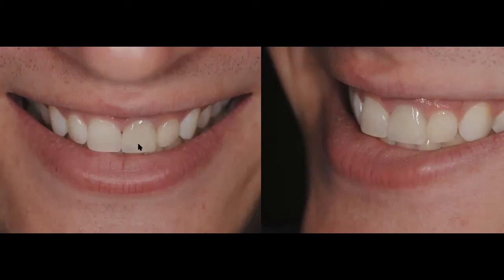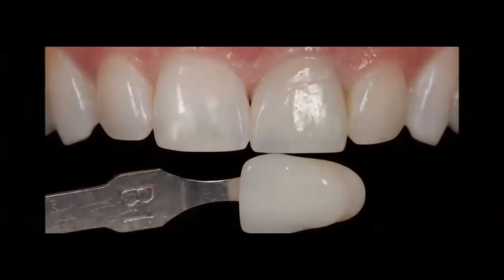This tooth appears to be gray. So that restoration, he did not fabricate a stump. He did not use my stump shade photo to fabricate a stump shade guide and seat this crown in the patient's mouth, because you can see through that crown. This is a lithium disilicate restoration, and you can see a little bit through that crown on the gingival aspect, that dark brownish color and the lack of higher value on this crown. So again, if you're a good lab technician and you're looking at a photo, these things should come up to you.